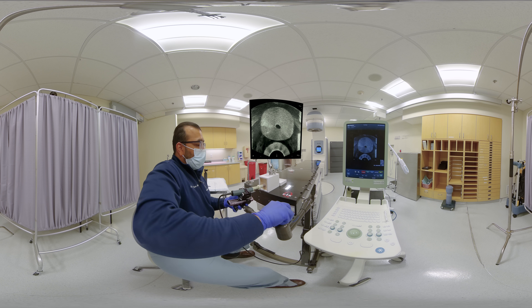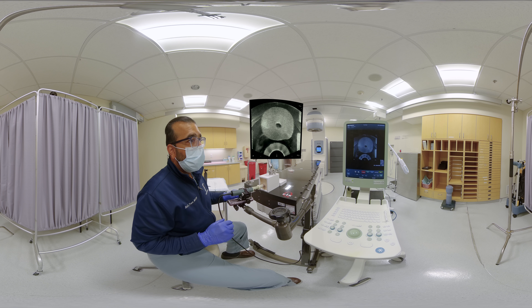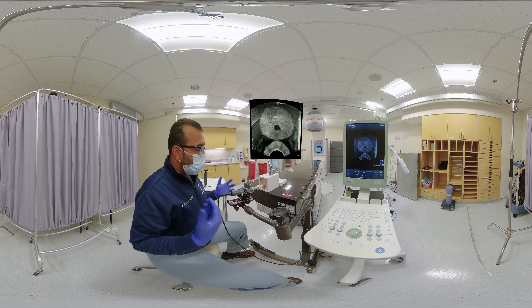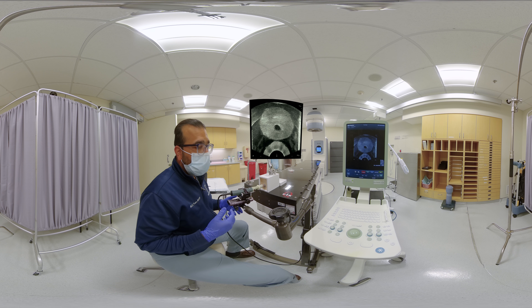Now we can scroll through the prostate gland on the axial view all the way from the prostate base, now down to the prostate apex, which is here. We'll go back to the mid-gland and discuss some ultrasound adjustment. Here are some common terminology we prefer for ultrasound adjustment. Please note there are institutional and practice-specific variations, but these are common starting points to aid in discussion and facilitate teaching.